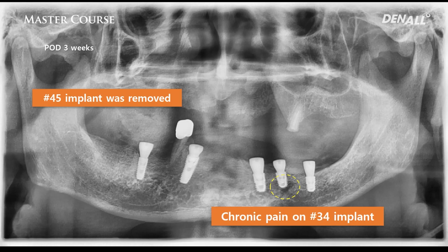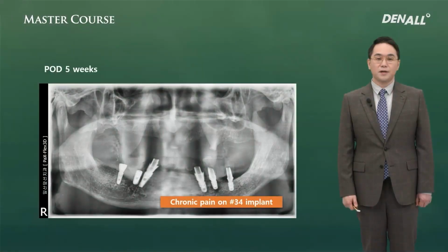That's when I thought that in number 34 there is heating necrosis as well. But at the time, there was no mobility on the implant. I thought maybe it would be okay, so I used the prepared prosthesis and provided a fixed prosthesis.